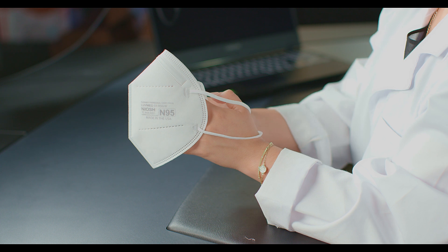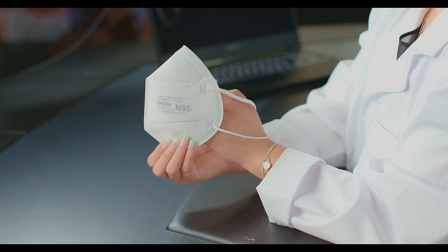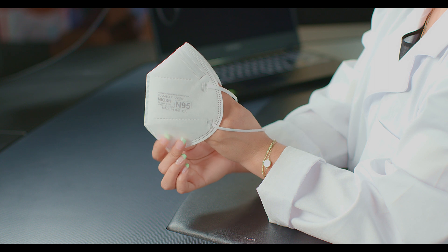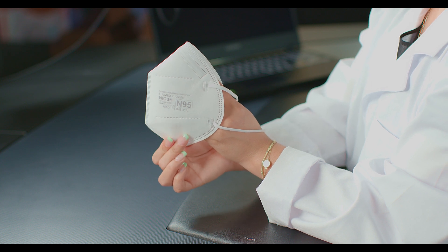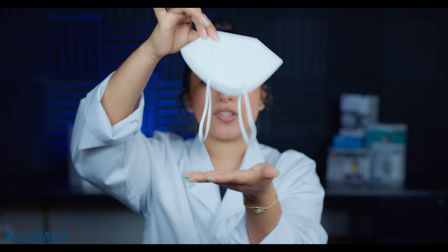Let's go ahead and take a look at these respirators. This does contain all of the N95 requirements: the manufacturer, the model, N95 NIOSH stamp along with the TC approval number and the lot number. They do seem very rough and papery thin. Both of the headbands are the same length, which is not ideal since they go around your head — one should be shorter and the other longer.